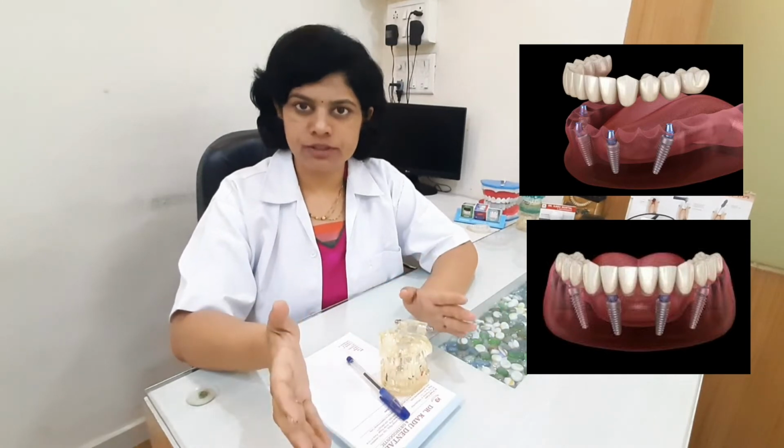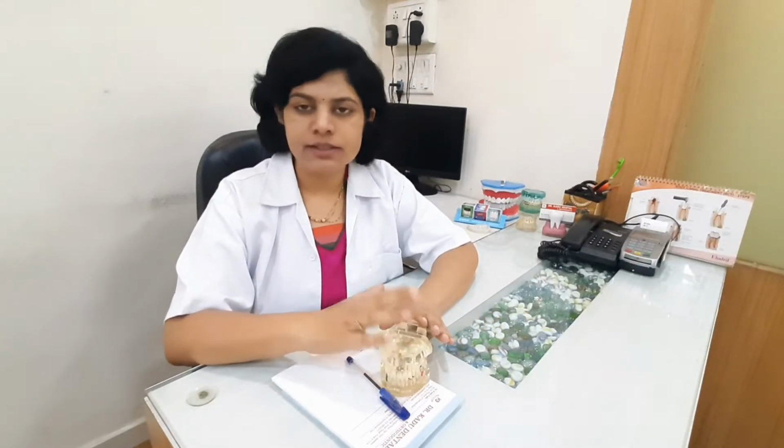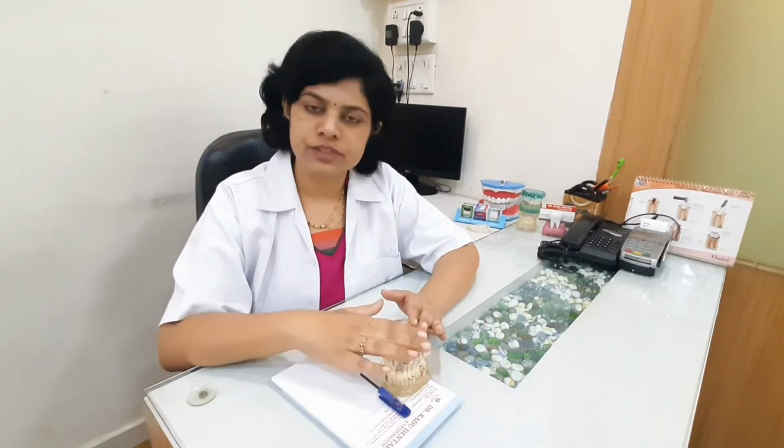Once we are ready with all the treatment plan, an actual appointment for the implant placement will be given to the patient. In that appointment, the proper sterilization and disinfection protocols are followed. Local anesthesia is given to make sure that there is no pain during the procedure.